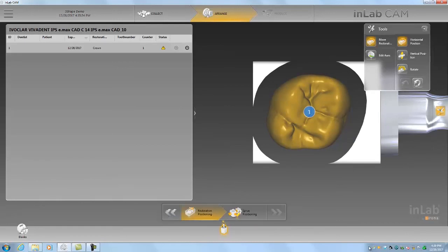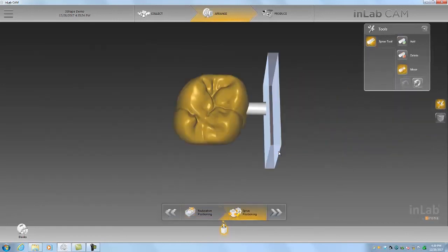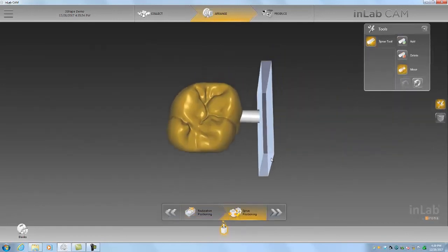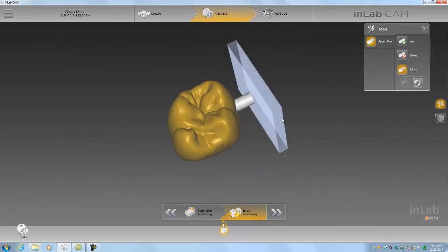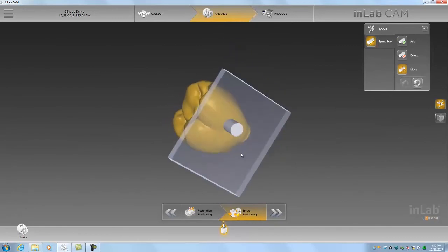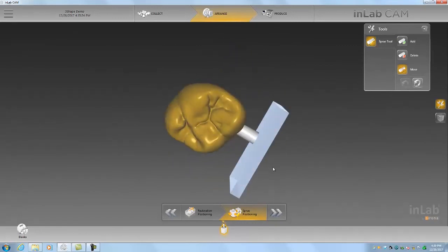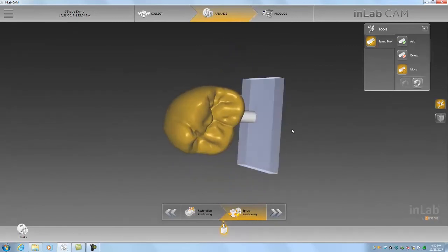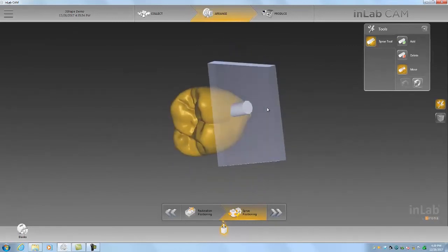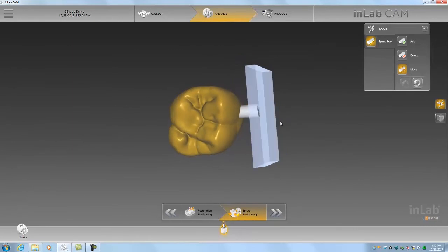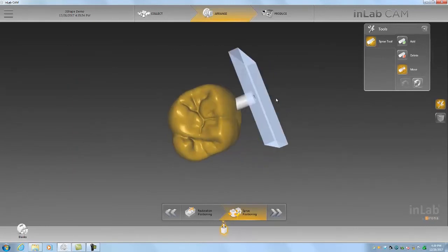You can see the CAM has also placed the sprue for us automatically. So we don't actually really need to do anything here. Let's see, we're okay with this, which looks good to me.